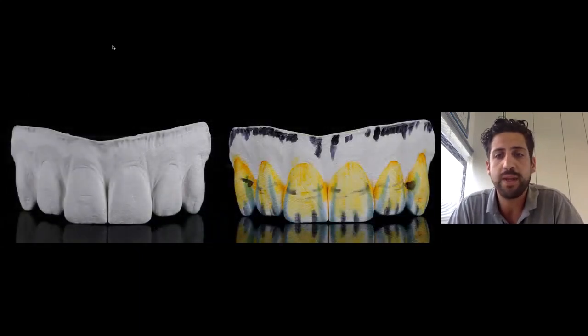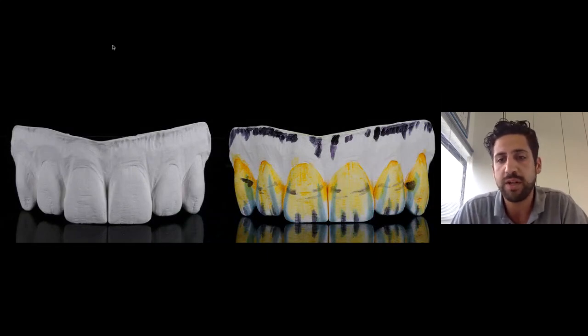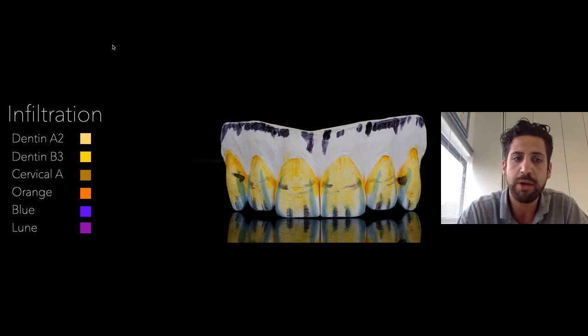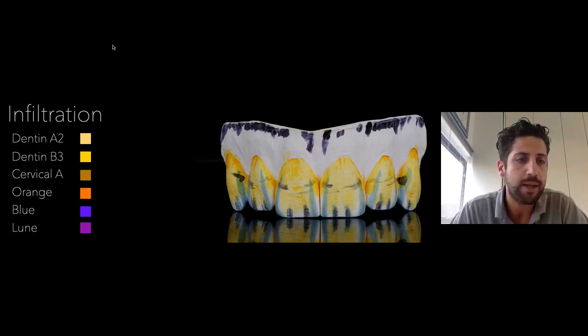And let's start with the characterization of the zirconia. First of all, we start with infiltration. I use, for example, in this case, Dentin A2 for the incisors, Dentin B3 for the canines, and cervical A. I just put a little bit of cervical A on the cervical side and interproximal, and orange effect for the interproximal and cervical. And then blue effect and lune effect for the incisal edge.